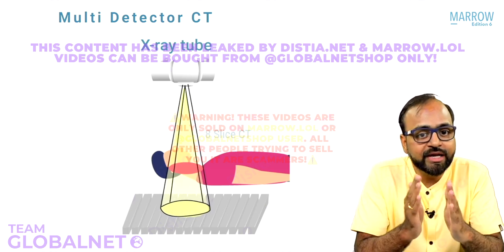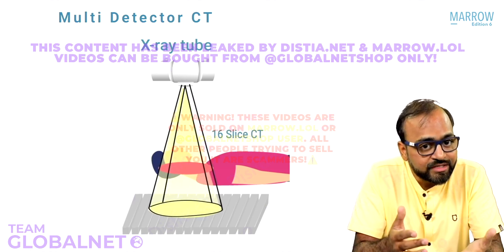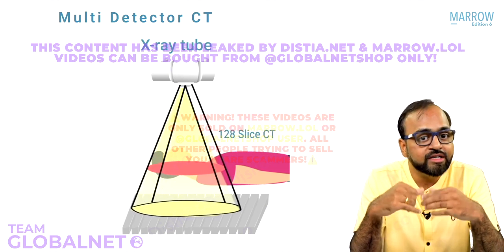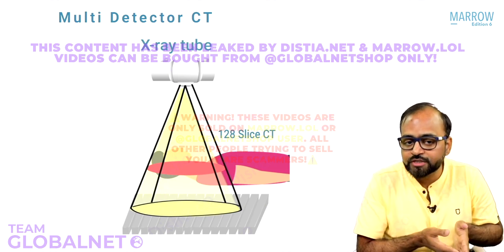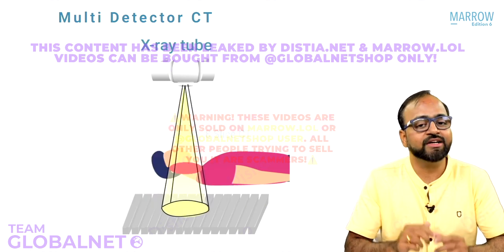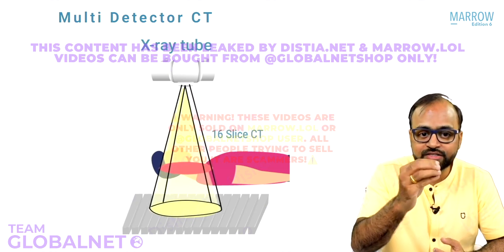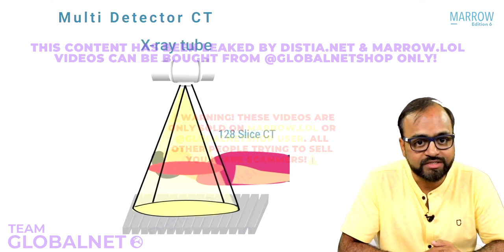So it can be an 8-slice multi-detector CT, or it could be 16 slice, or 64 slice, or 128 slice multi-detector CT, in which in one cut across the patient's body, 128 slices of the patient's body are obtained. See how fast this particular machine is, right? Therefore, most of the machines that we use in our hospitals today are at least 8 slice or 64 slice or at least 128 slice CT scanner machines.